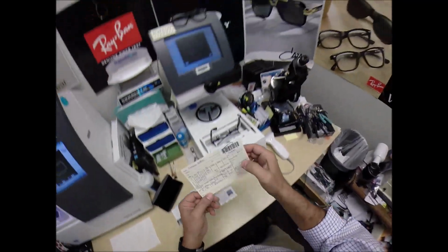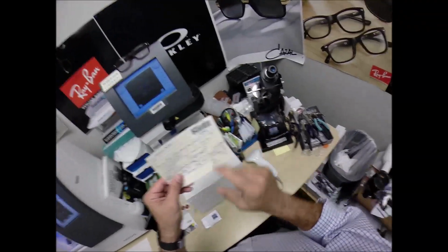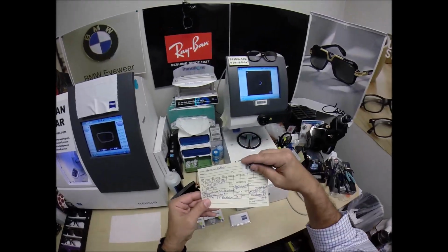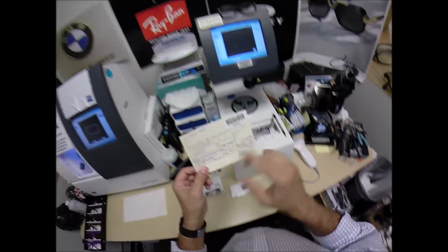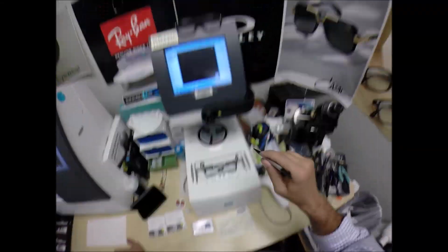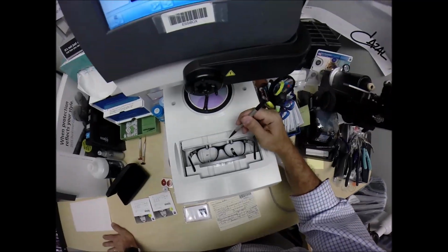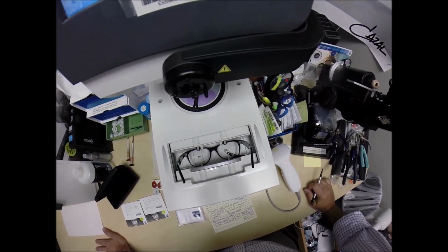So I want to program this shape into the computer so that years from now, should I ever need new lenses, I can just pull this up. This is mostly for others. I can always cut more for me, but if anyone else were to buy this, I would assign a number to this when I cut your lenses. That way, should you ever need more lenses for any frame that I offer out, they'll be programmed into the database. I'm going to hit the start button. Little stylus is going to pop up. It's going to go around, trace the inside bevel of the right side of the frame before doing the same thing on the left.